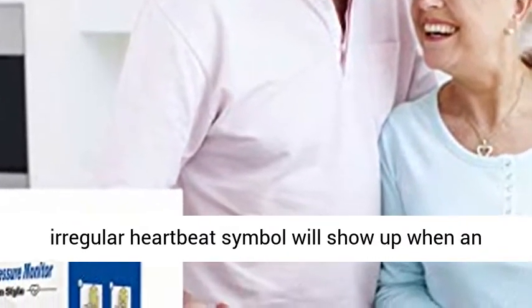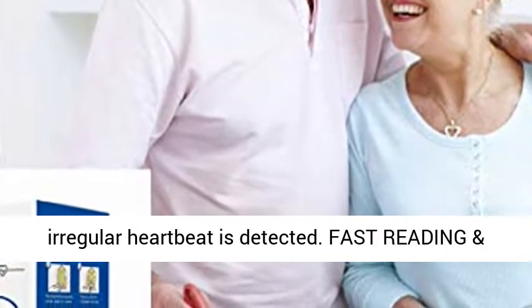Irregular heartbeat indicator — the irregular heartbeat symbol will show up when an irregular heartbeat is detected.